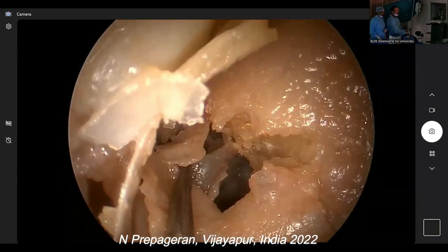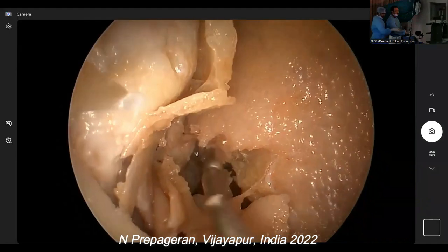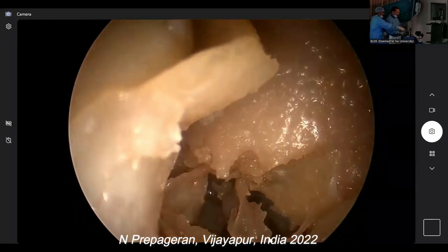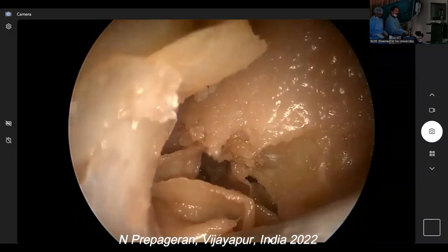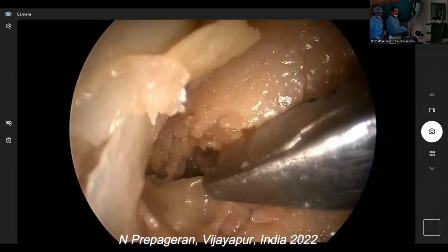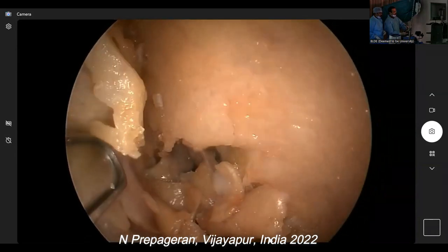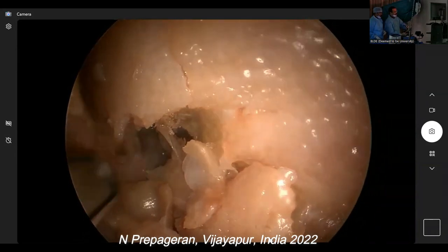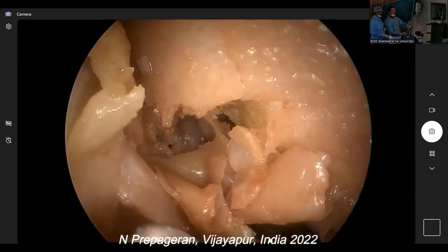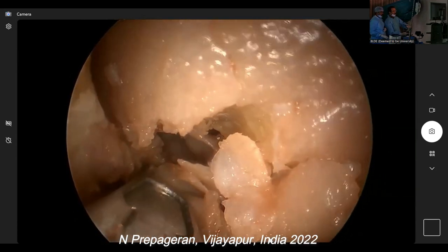So once we have done that, this is Draf 2A, correct? If we cut up to the middle turbinate. Yes, sir. Up to the middle turbinate here. Can you see? I'm going to enlarge this up to the middle turbinate. That's Draf 2A. Correct? If I enlarge up to the septum, that's 2B.